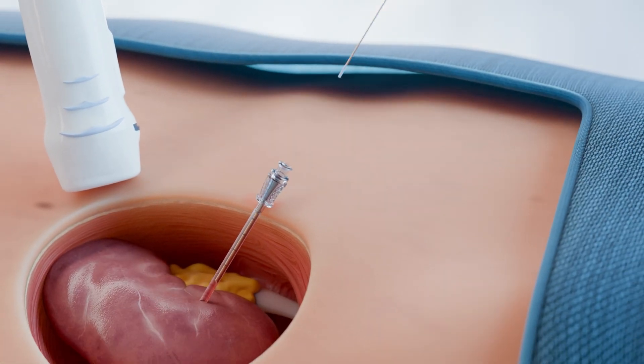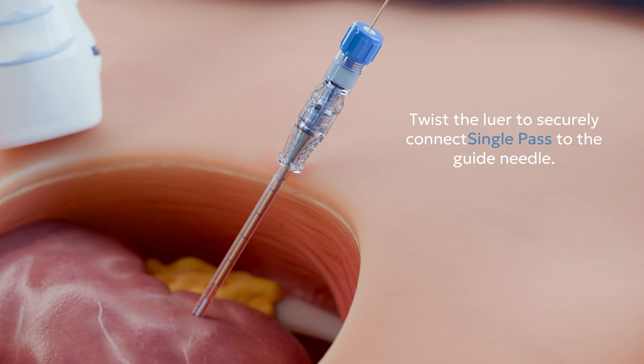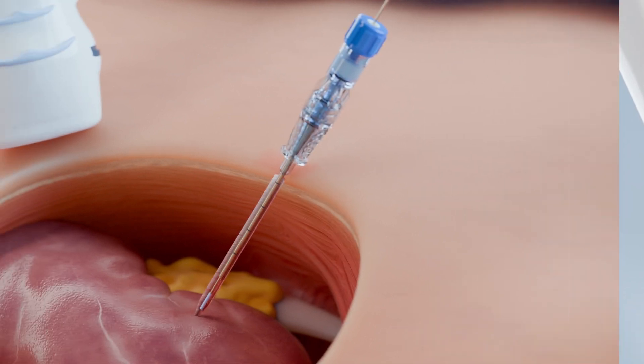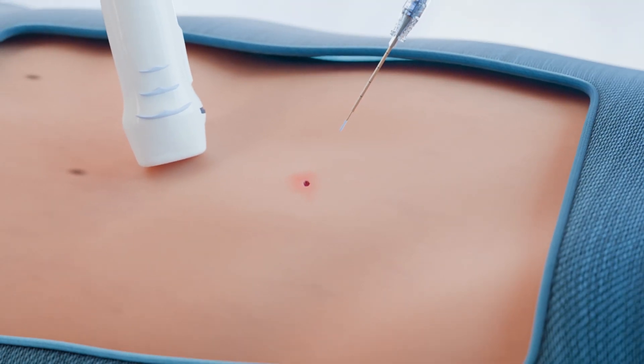Next, insert the Single Pass probe through the guide needle while the needle is still in the patient. Thanks to earlier setup, the Single Pass device probe tip will extend the same distance as the tissue extractor. Twist the lure to securely connect Single Pass to the guide needle. After that, activate the heating element by depressing and holding the gray power button. Wait 10 seconds and then begin slowly withdrawing both the guide needle and Single Pass device together.